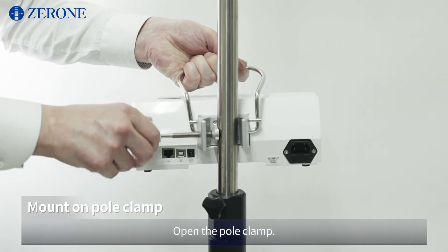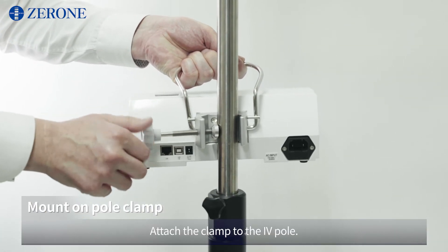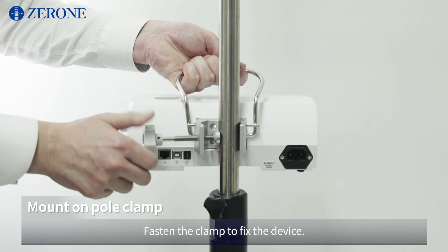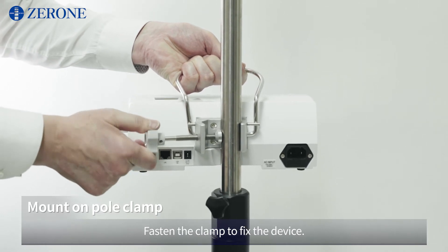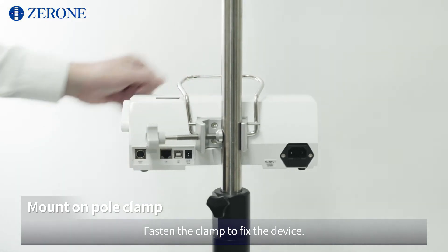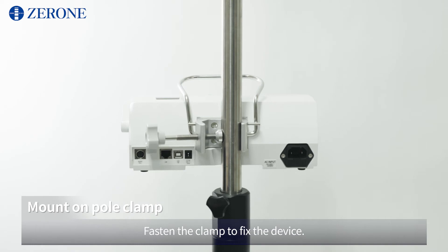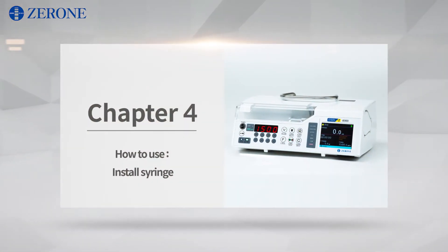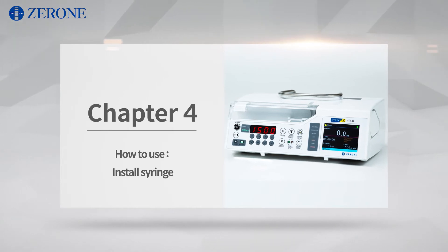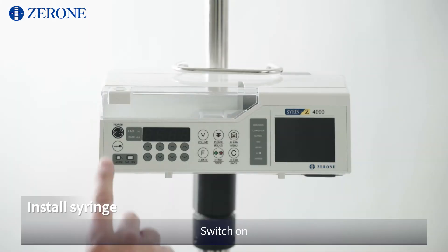Open the pole clamp. Attach the clamp to the IV pole. Fasten the clamp to fix the device. Switch on.